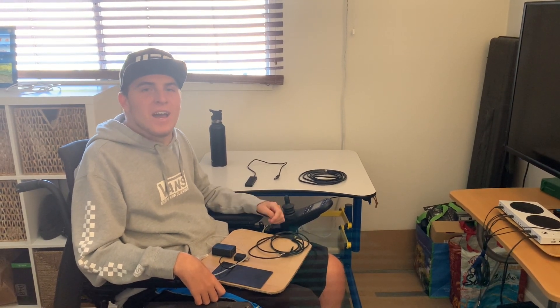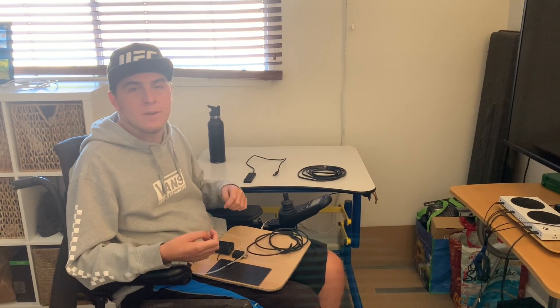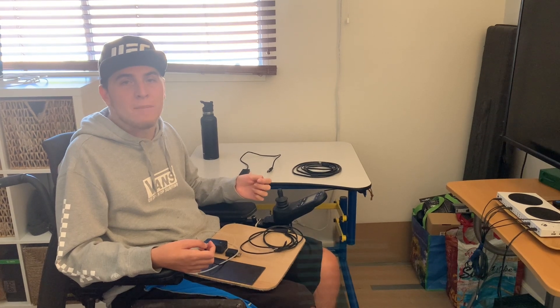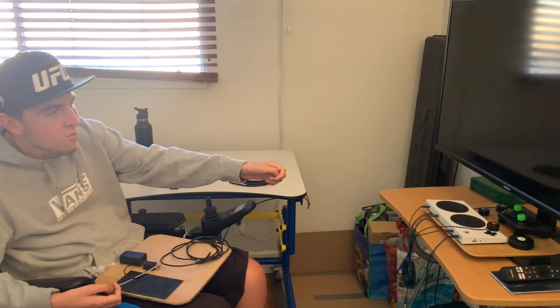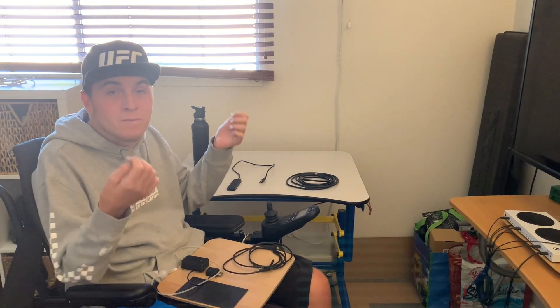Hey everyone, welcome back to another video. Today I wanted to show you this cool new sip and puff adaptive gaming device that I got, which allows me to play video games. For those of you that have been watching for a while, about a year ago I purchased the Xbox Adaptive Controller, which is right there on my TV, and that basically allows me to play video games being a quadriplegic.